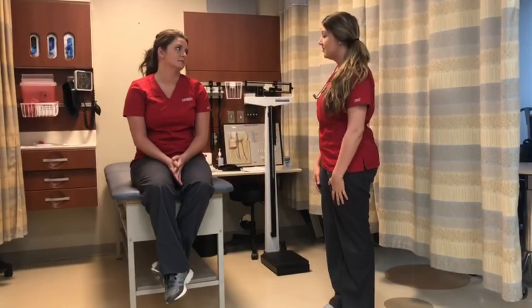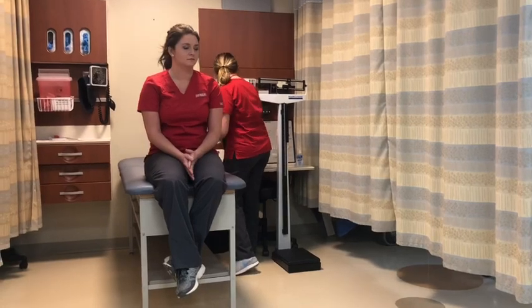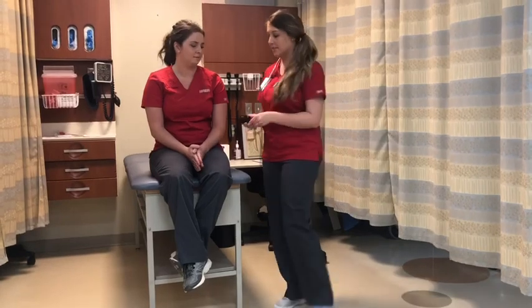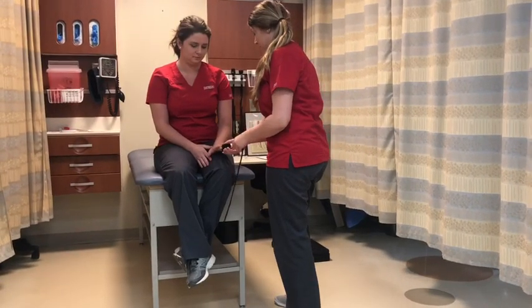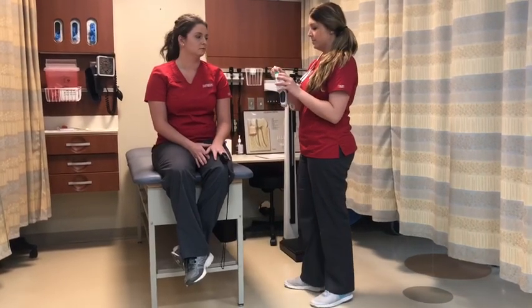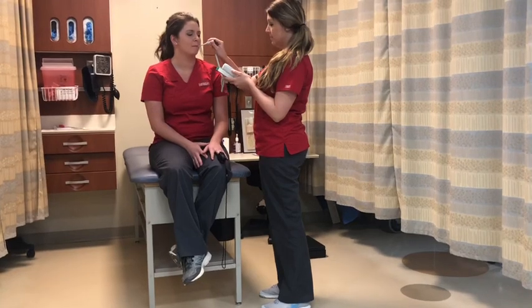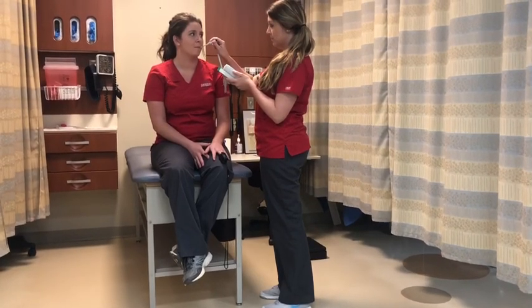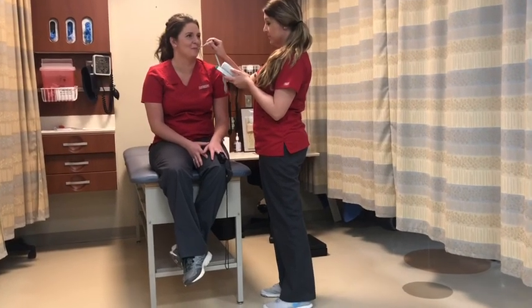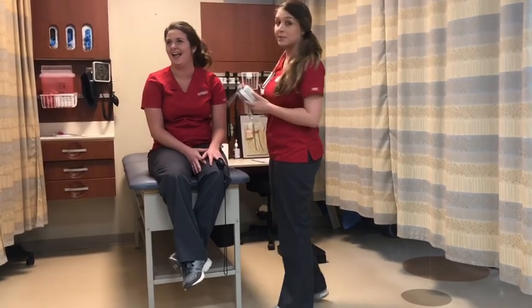Okay, Maddie, I'm going to take your vitals now. I'm going to gather my supplies, my thermometer, my blood pressure cuff, and my pulse oximeter. Okay, I'm going to put this on your finger. I'm going to take your temperature right under your tongue for me. Okay, patient's temperature is 98.